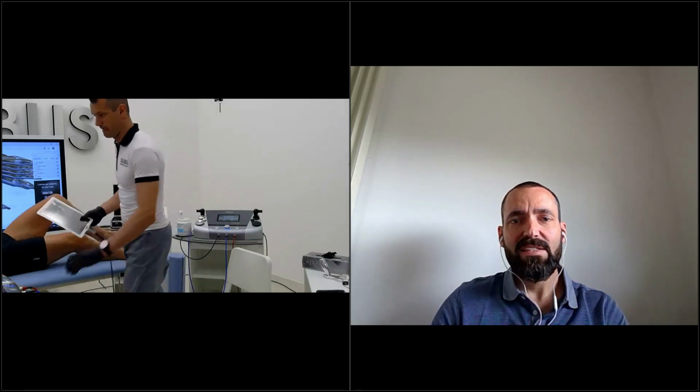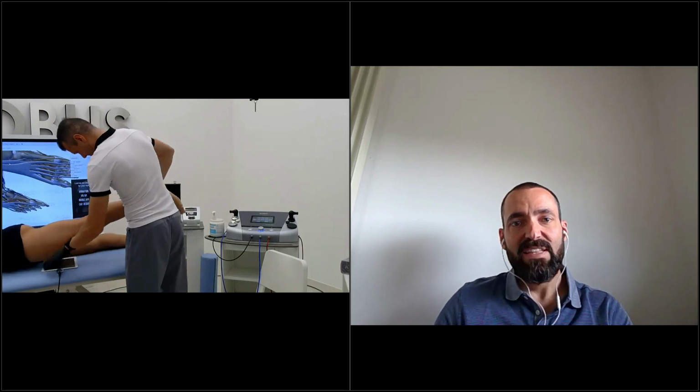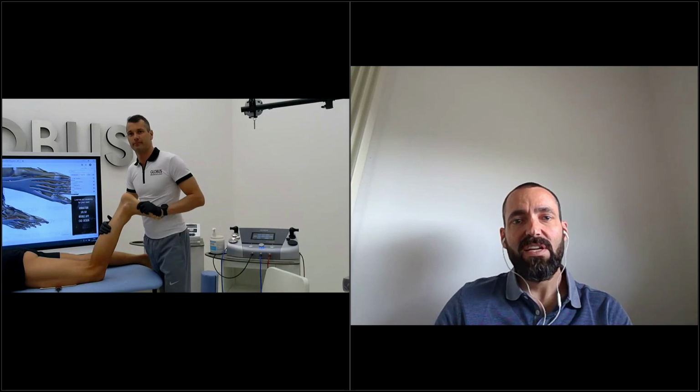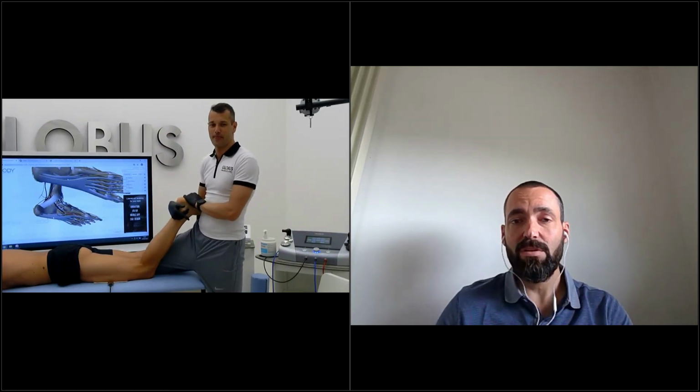In the other positions, lying on the back, lying on the front, it's very important, in my opinion, to always treat the fasciae and soleus, because when you have a tendinitis, a metatarsalgia, or a plantar fasciitis, we always have this calf stiffness, usually in the distal part of the calf. So we cannot say that this stiffness is creating the tendinitis, the fasciitis, or the metatarsalgia, but for sure in that pathology we have this.